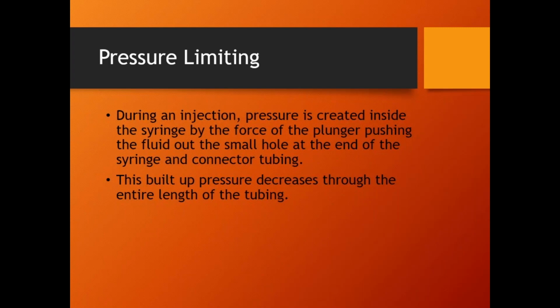Hopefully, most of the time, to be honest, if that does occur, we're still fine. We'll still get the image that we need. If the injection stops, we definitely have to do this again. If we just slow the flow rate down, we might have to do it again. But most of the time, we're still getting fluid flow to the region of interest. It's most likely the image is going to be good. If that occurs, 99 times out of 100, it's operator error.